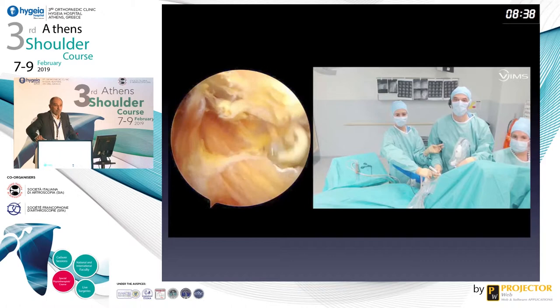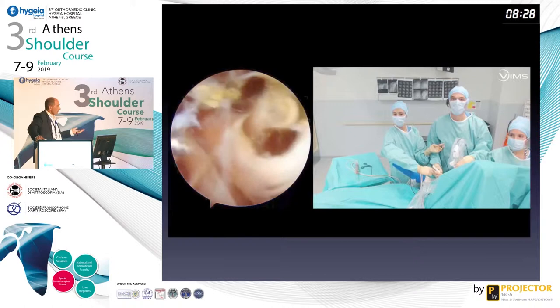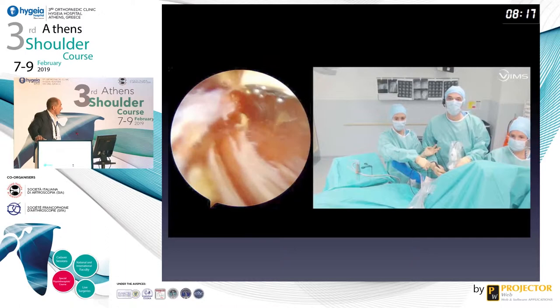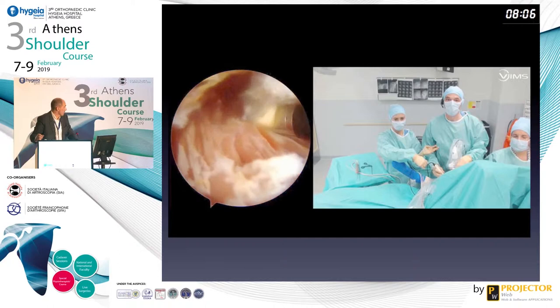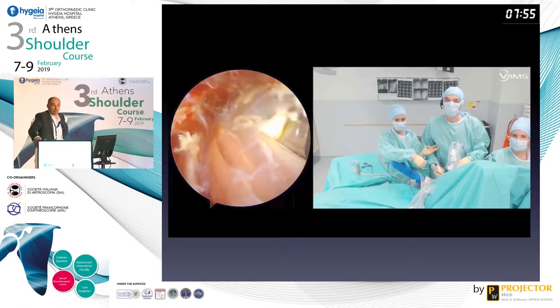the footprint of the subscap. So you can see at the distal part of the movie, this is the muscle belly of the teres major, and at the upper part, the white, very thin structure is of course the lat dorsi. Be careful and take care on the left of your picture, because remember that you still have the axillary and circumflex vessels, but now you have to go as deep as possible, and most of the time the limitation you have is the length of your scope or the length of your electrocautery, because you have to go as deep as possible, but sometimes we have to imagine new instruments to go deeper.